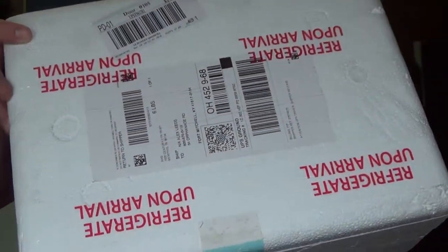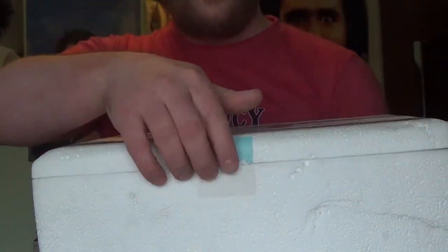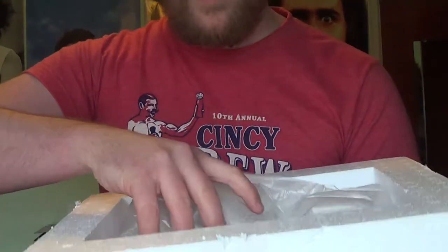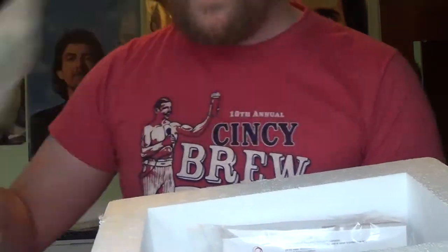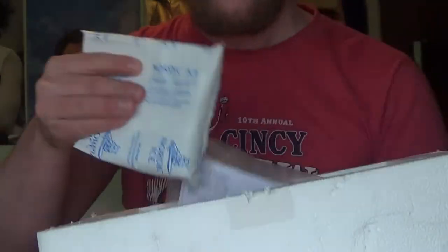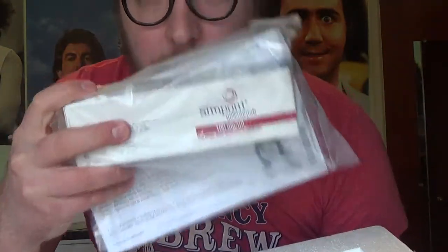See that styrofoam pop off. It says refrigerate. Let's see what we got here. We have some bubble wrap. I got four of these — they put four ice packs in here.